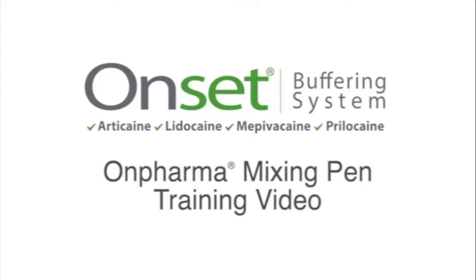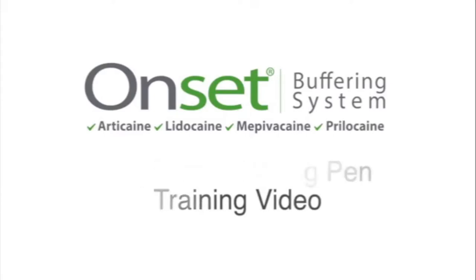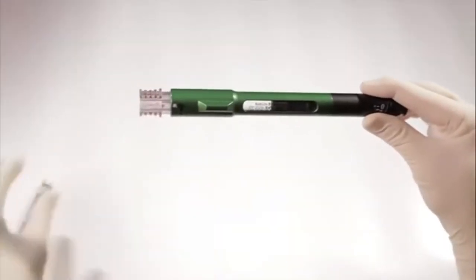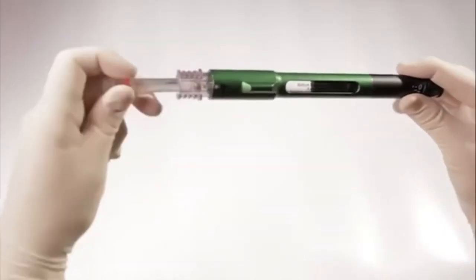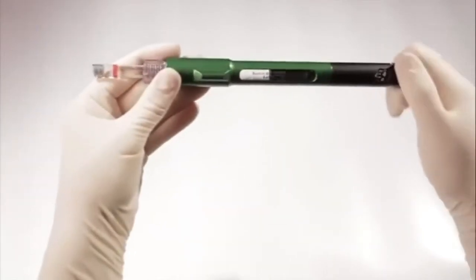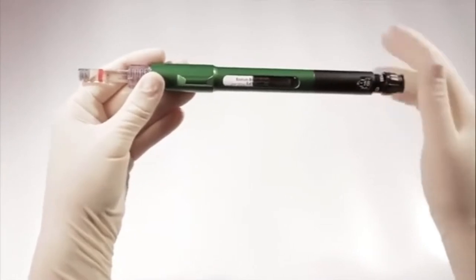Hi, I'm Mick Falco, Founder and Chief Medical Officer of On Pharma. The following video will take you through the steps necessary for precision buffering. This video will show you how to easily and precisely mix two parenteral solutions using On Pharma's mixing pen and cartridge connector. The mixing pen is easy to use and conveniently provides a method for clinicians to precisely and safely compound two parenteral solutions via a sterile fluid path.